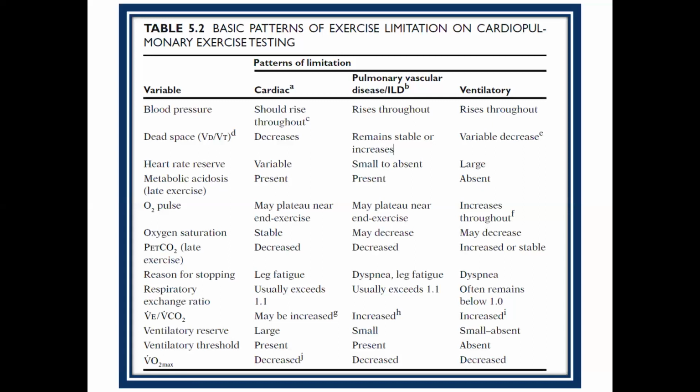Yes, thank you. Okay. So the way to prove this, like I said, you can look at the trends on a CPET machine. It will tell you VD to VT with exercise. It will give you the whole table. But the real way is to do an ABG. And a lot of programs like Mass General do ABGs as standard.